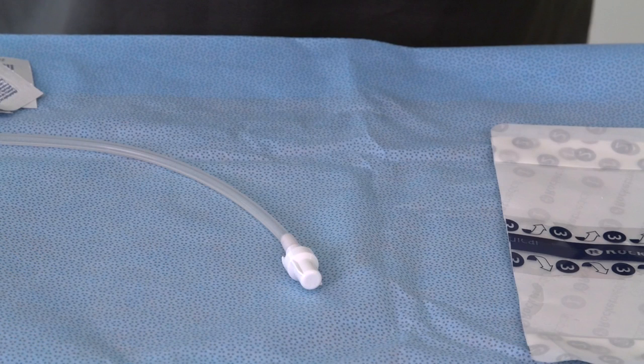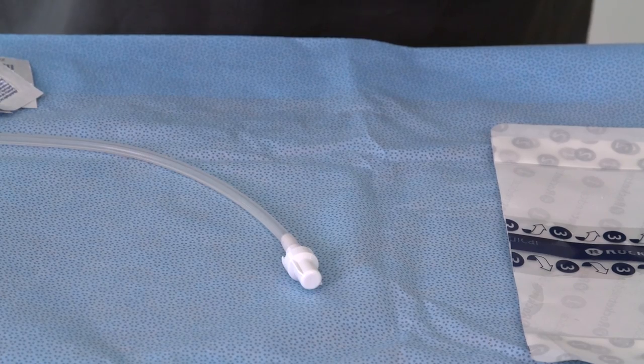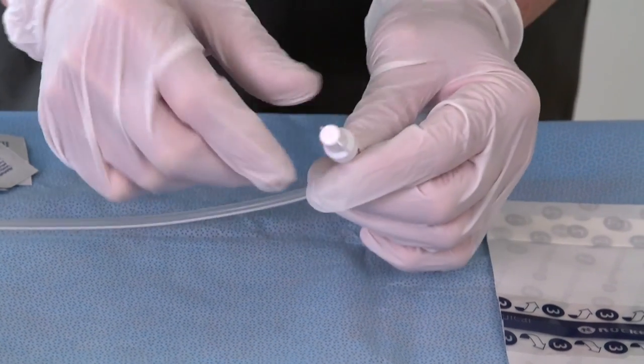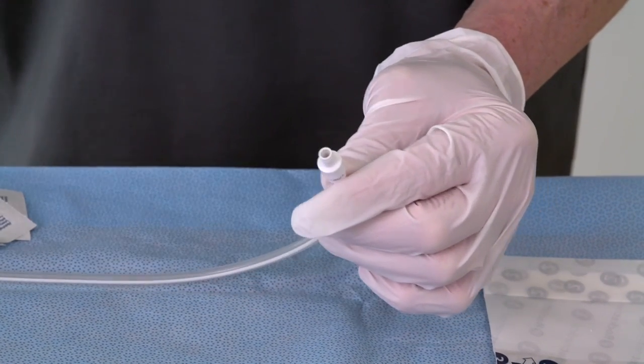Now it's time to connect the ROCKET IPC drainage system to the patient's catheter. Remove the catheter cap by rotating the cap counter-clockwise and gently pulling. Then discard the cap.